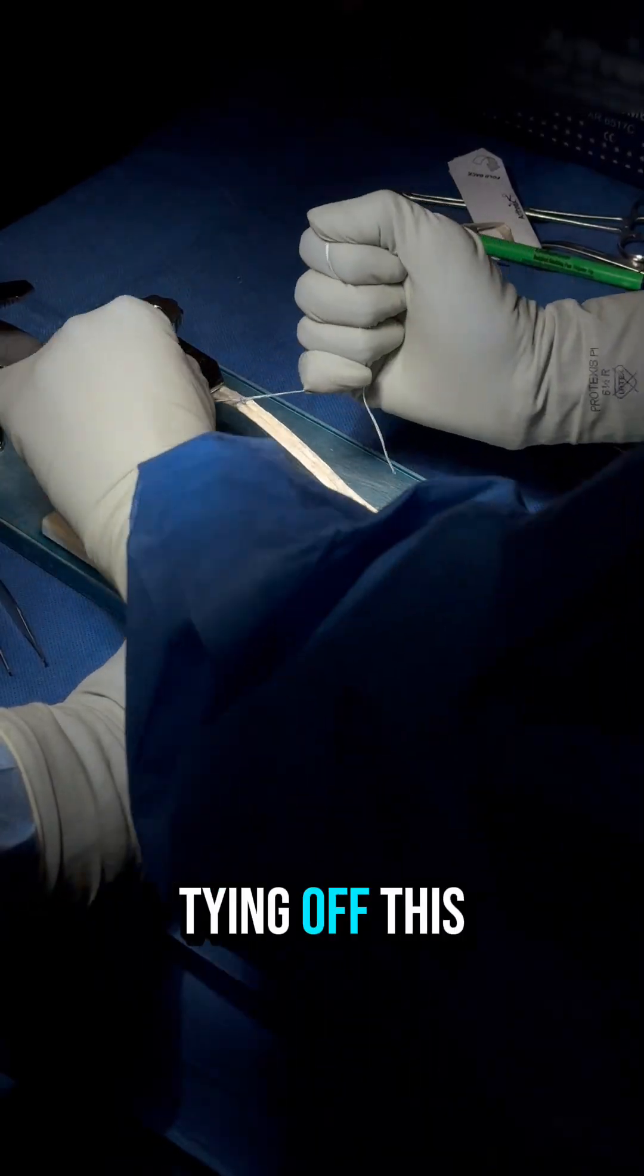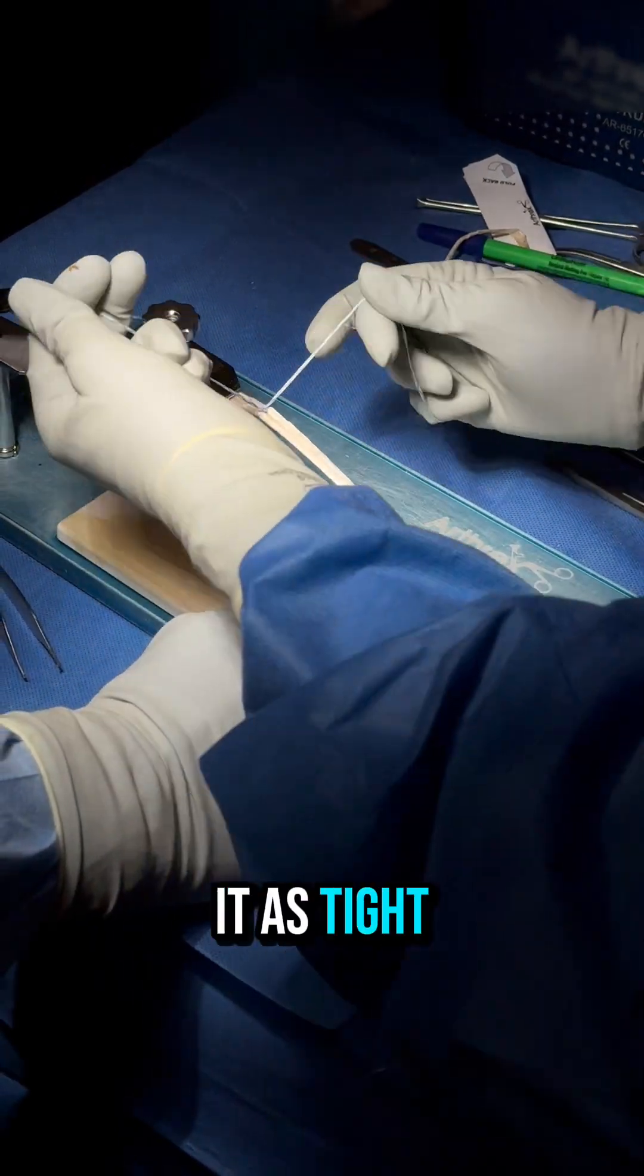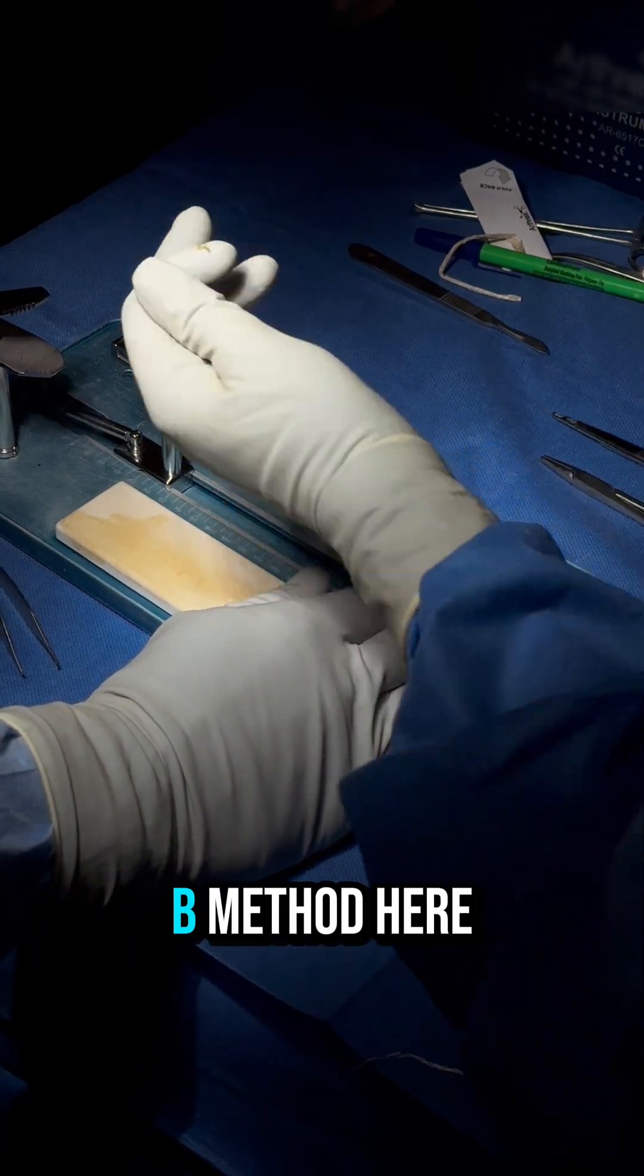It's important when tying off this end to make it as tight as possible, and we use an AAB method here.